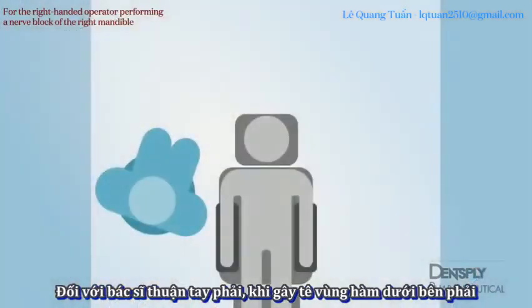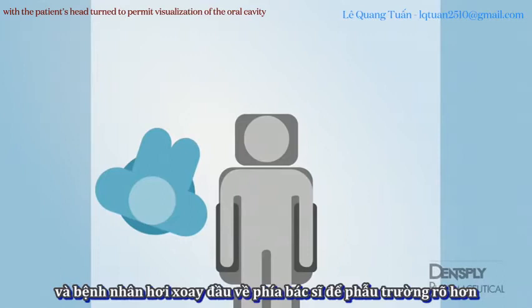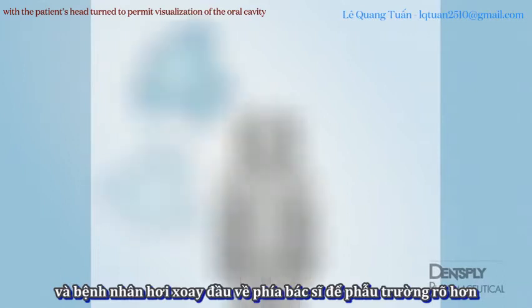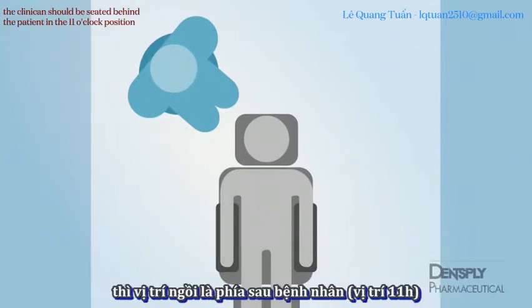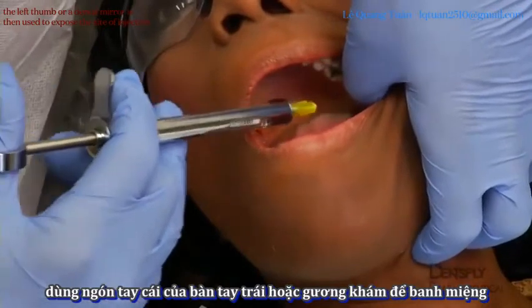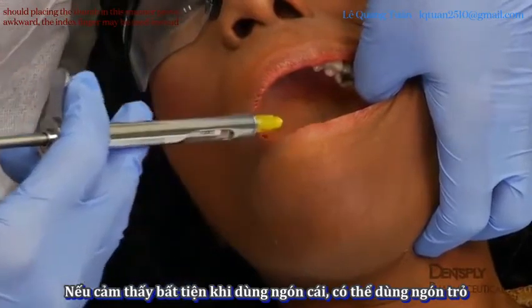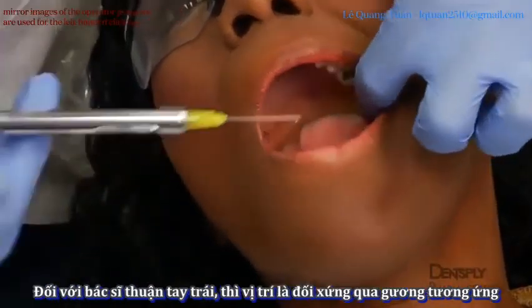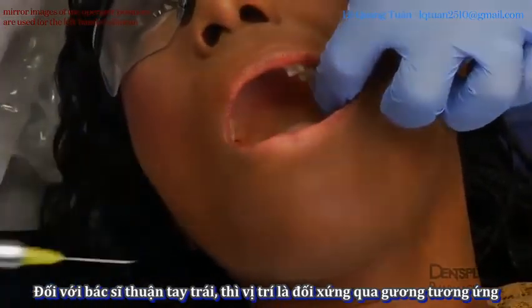For the right-handed operator performing a nerve block of the right mandible, the clinician should be seated in front of the patient, with the patient's head turned to permit visualization of the oral cavity. For a right-handed operator performing a nerve block on the left mandible, the clinician should be seated behind the patient in the 11 o'clock position. The left thumb or a dental mirror is then used to expose the site of injection. Should placing the thumb in this manner prove awkward, the index finger may be used instead. Mirror images of these operator positions are used for the left-handed clinician.